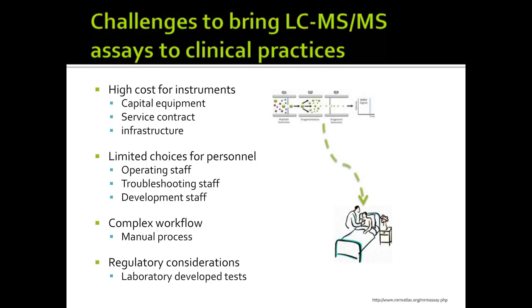It requires a lot of manual process, and it's not automated, and requires special training for the staff and for the laboratory to accommodate that. The third part is regulatory considerations as a laboratory developed test.